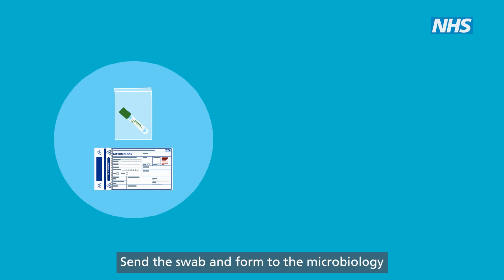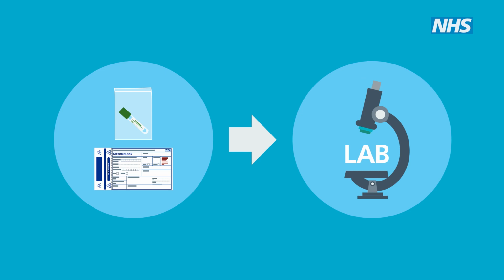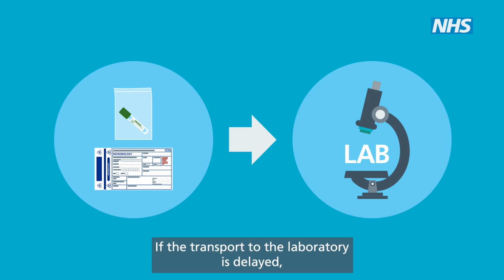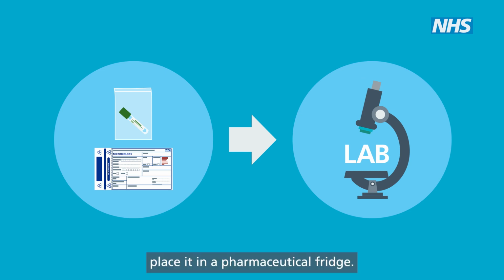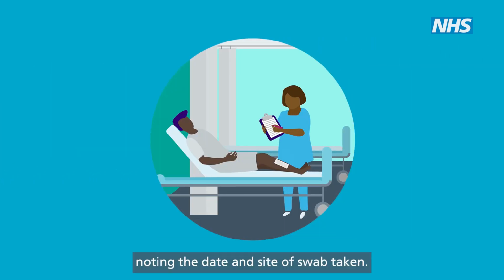Send the swab and form to the microbiology laboratory for analysis as soon as possible. If the transport to the laboratory is delayed, place it in a pharmaceutical fridge. Document the procedure in the patient's notes, noting the date and site of swab taken.